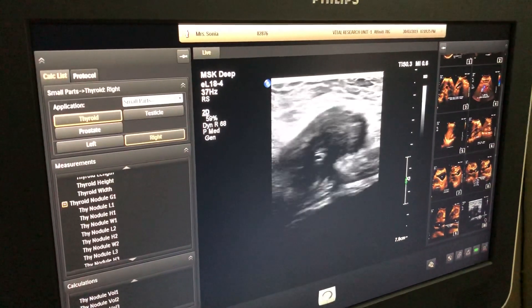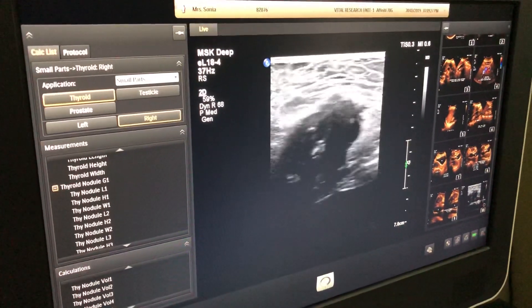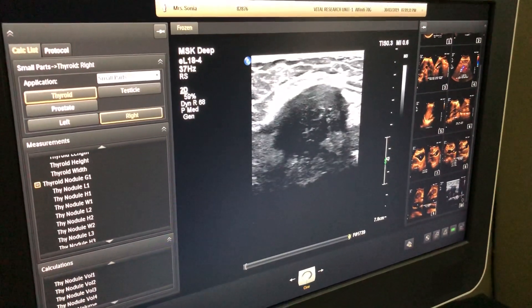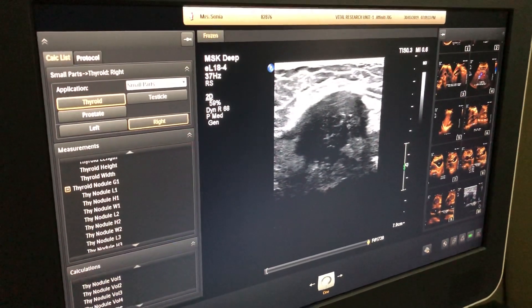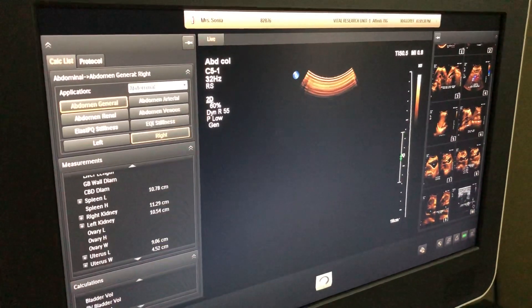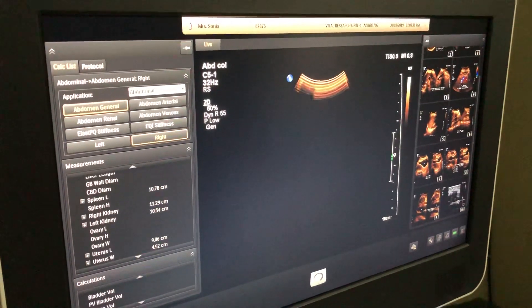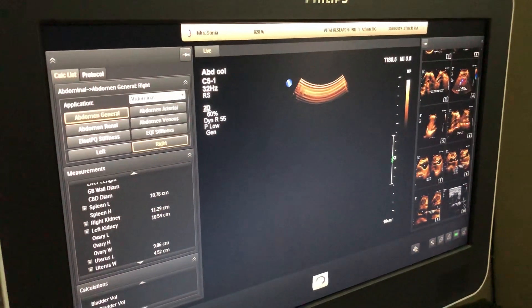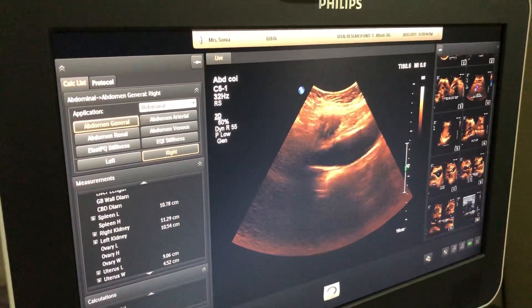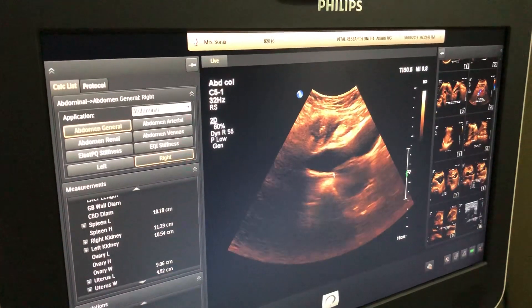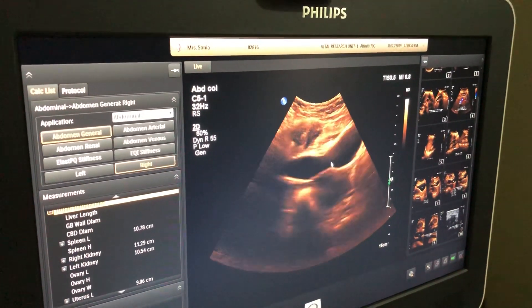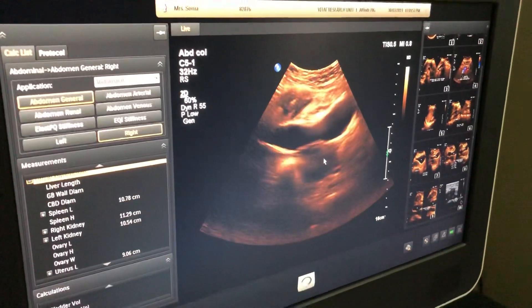We are now doing the ultrasound using a high frequency transducer. We have also used the low frequency 5 MHz transducer, with which we found this type of lesion in the subcutaneous tissue. This is the bladder and this is the uterus.